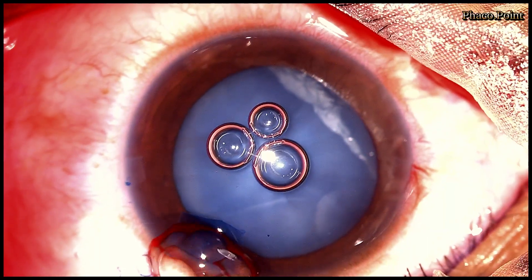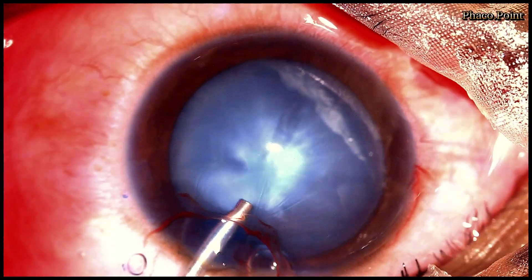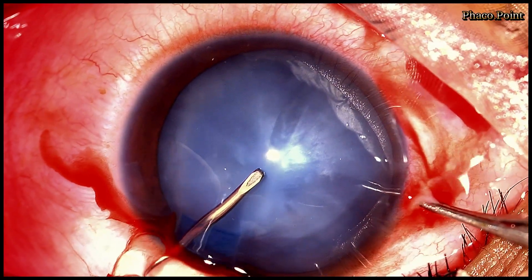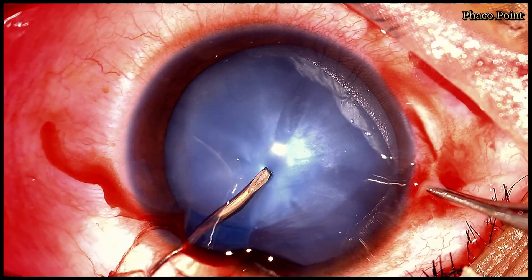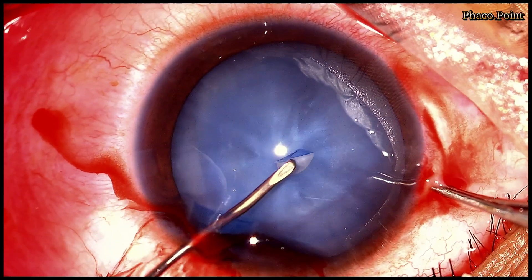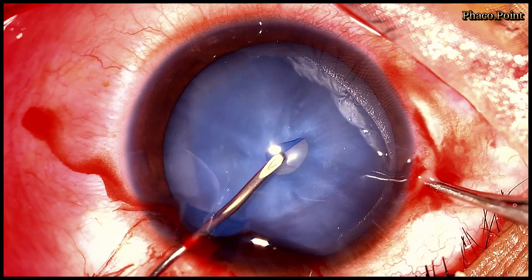In cases of an intumescent cataract, I always use a cohesive or dispersive viscoelastic to flatten the anterior capsule. We now start with the double rhexis. The initial nick in the anterior capsule is made like a small circular shape with the help of a well-fashioned cystitome.